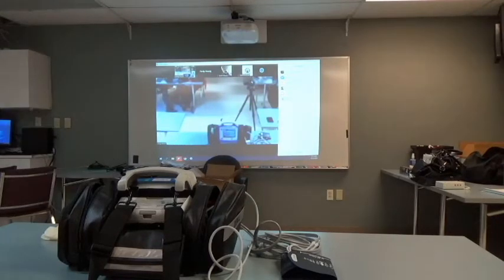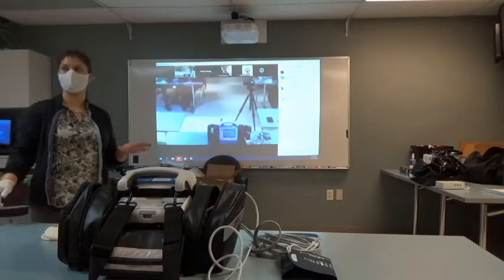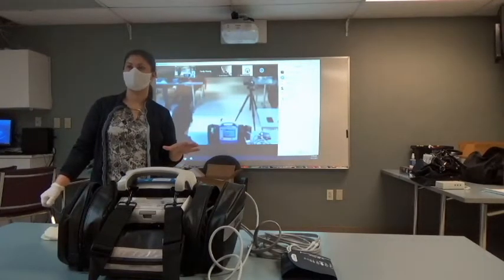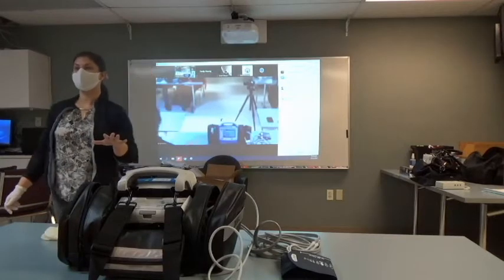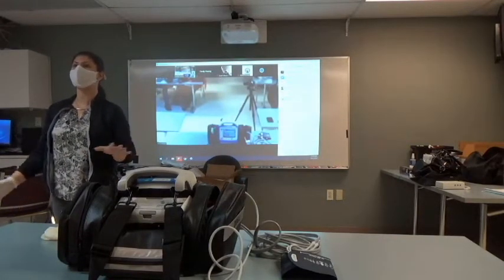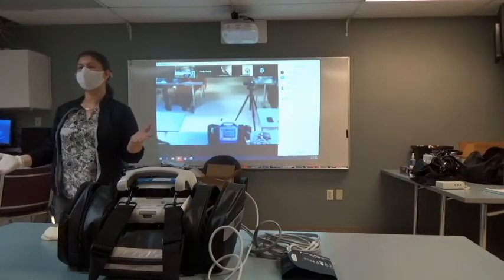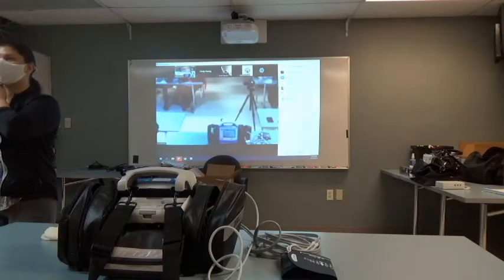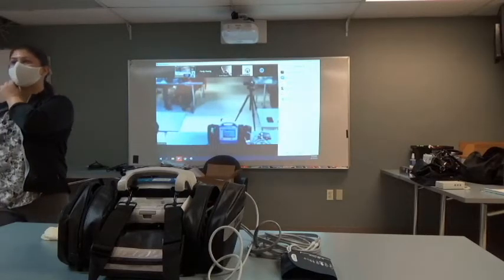Is there a way to set the auto pressures up to be automatic as soon as you turn the device on? The actual pressures? Yeah, because I know most of us are divas and don't have to push buttons to get repeating pressures every 5 or 10 minutes. So you want it to be auto in automatic mode? Yes. It can power up that way. It's a configuration. Okay. So it's just a configuration. I'm sure that decision will come from management, but I know that's what we currently run, and I think we're all pretty used to it.